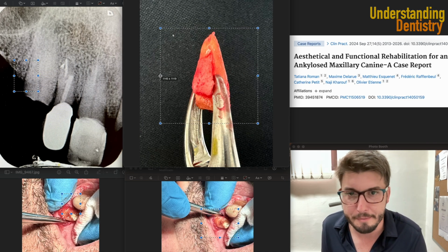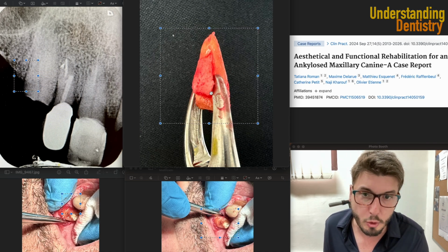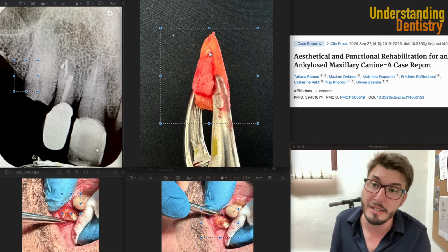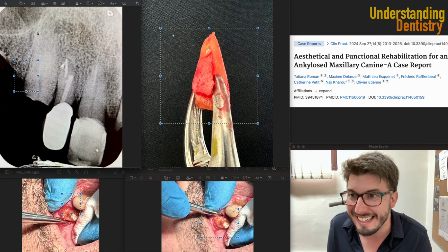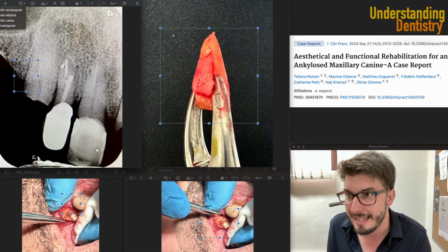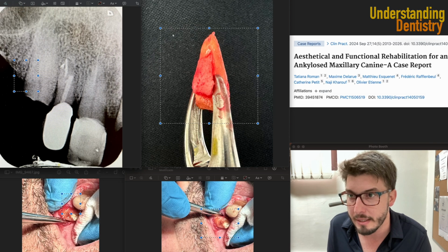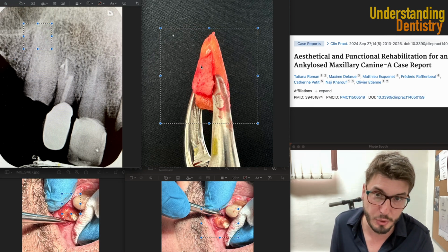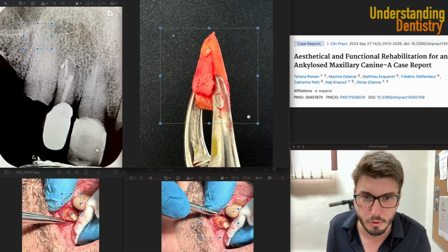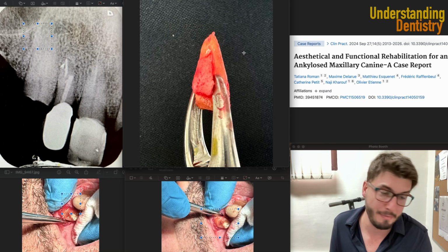So you have the ankylosis, the cortical bone, which was fused, and it is still fused to the cementum of this tooth. Of course, the location is not completely accurate as assessed from the periapical radiograph, because that's 2D, and this is 3D. So maybe we are seeing a little bit more like this area here, but it's basically 2D.